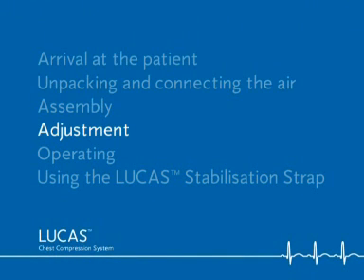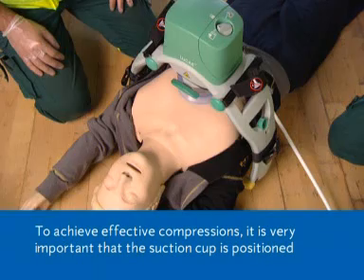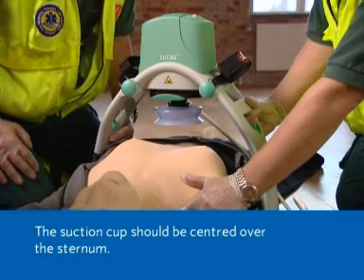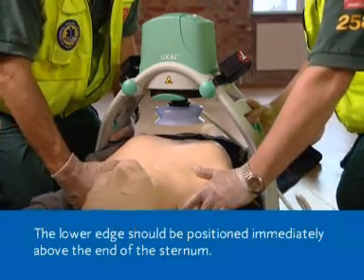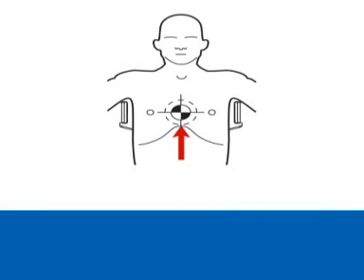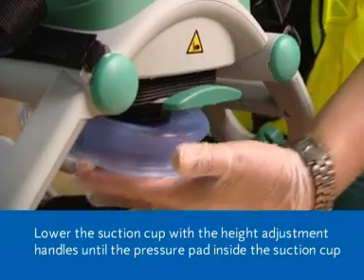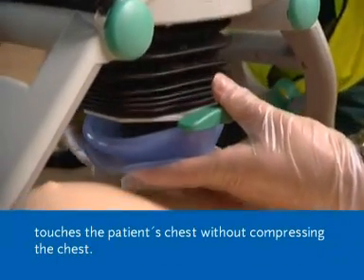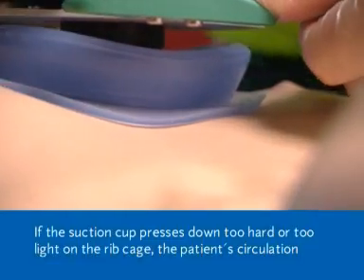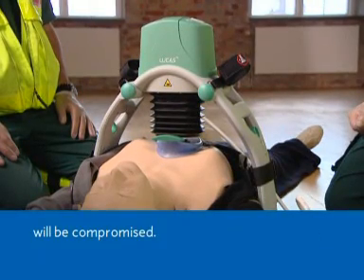Adjustment. To achieve effective compressions, it is very important that the suction cup is positioned correctly in relation to the patient. The suction cup should be centred over the sternum. The lower edge should be positioned immediately above the end of the sternum. Lower the suction cup with the height adjustment handles until the pressure pad inside the suction cup touches the patient's chest without compressing the chest. If the suction cup presses down too hard or too light on the ribcage, the patient's circulation will be compromised.